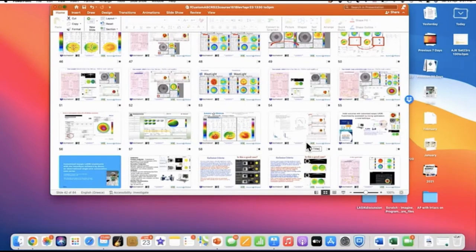That's a very good point, and there's not a good answer for that as well. It's very unusual that your topographic data will be very different than your manifest. If they are, you need to validate your topographic data with total cornea data. So you always have to correlate. Unfortunately, in the U.S., the only topo-guided available is the one using reflection topography. So it's reading the anterior part of the cornea only. So you want to go to your Pentacam and make sure that the Pentacam shows a similar amount of astigmatism and axis.